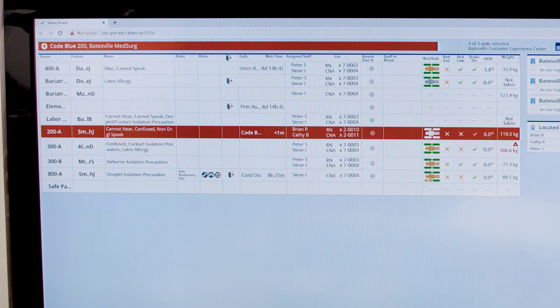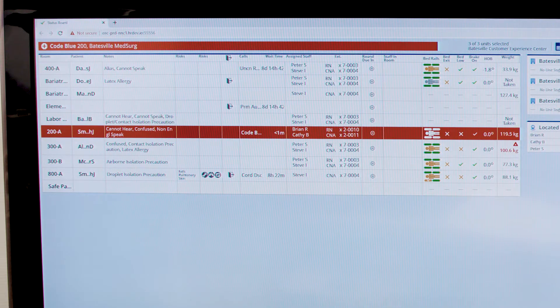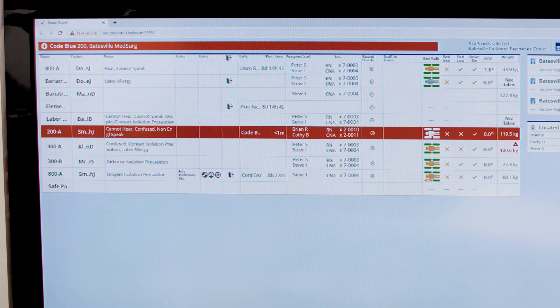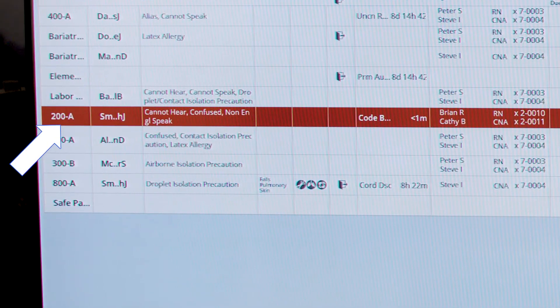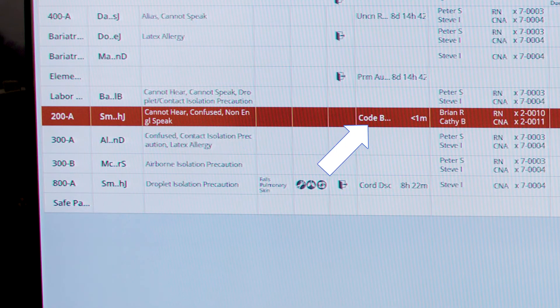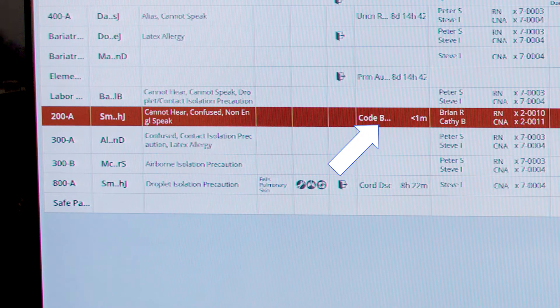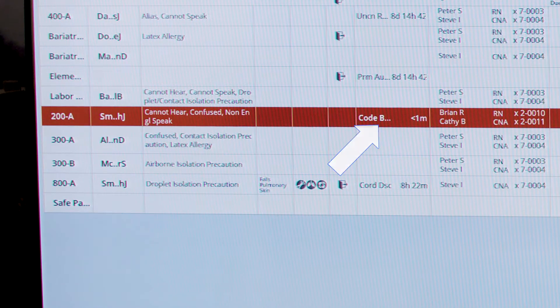If we activate a code blue, which is a priority call, you can see on the ribbon it's illuminated in the color red as a quick identifier of the patient room and what type of emergency call is occurring. Here we have code blue.